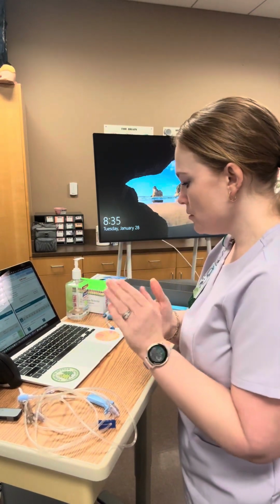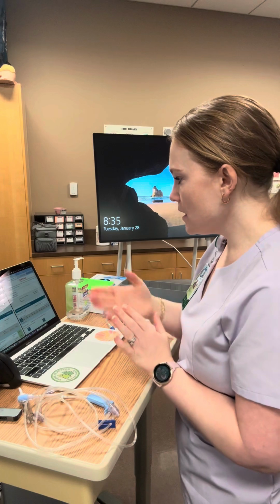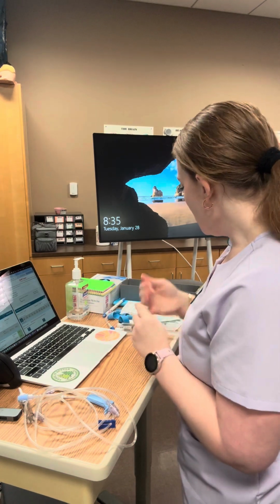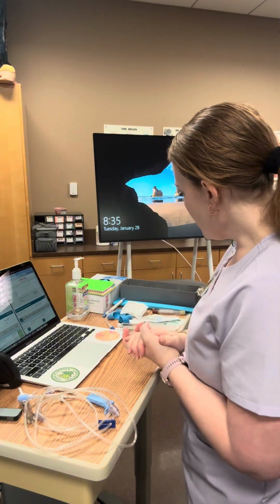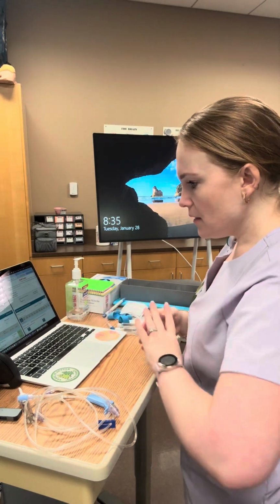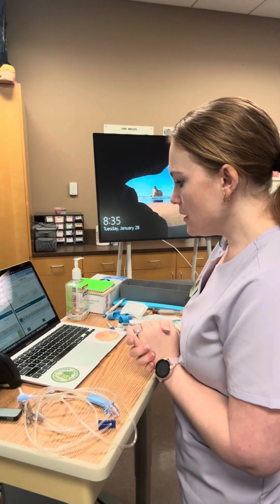And I'm going to ensure that I have all of the equipment that I need here. I have my EHR tutor pulled up. I made sure that I have my orders and my MAR ready to go. I have all of the equipment that I'm going to need, including the medication bin. I've got the pad, I've got a pen, my literature, the IV catheter, I've got my tubing, I've got the scanner. Everything is in place, ready to go and laid up in an order that makes sense for me.